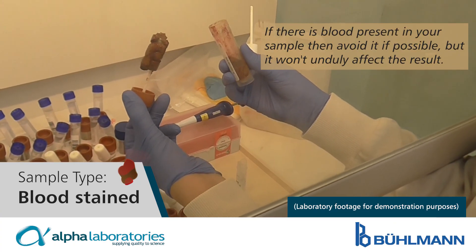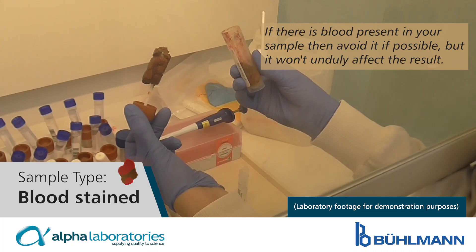Bloodstained. If there is blood present in your sample, then avoid it if possible, but it won't unduly affect the result.